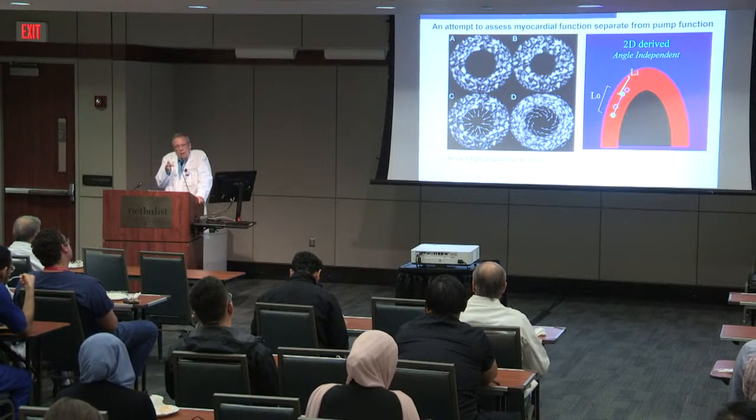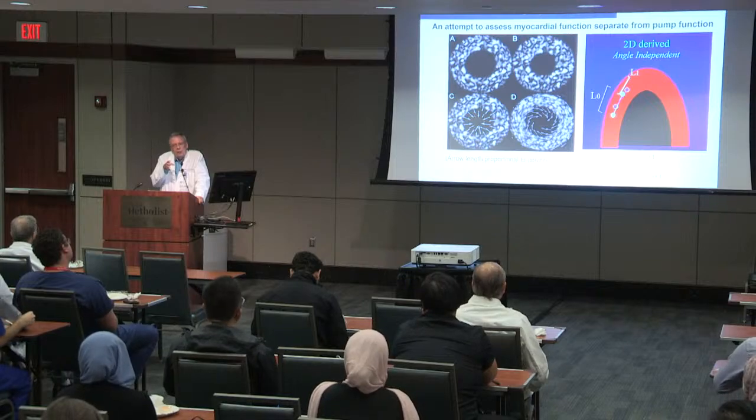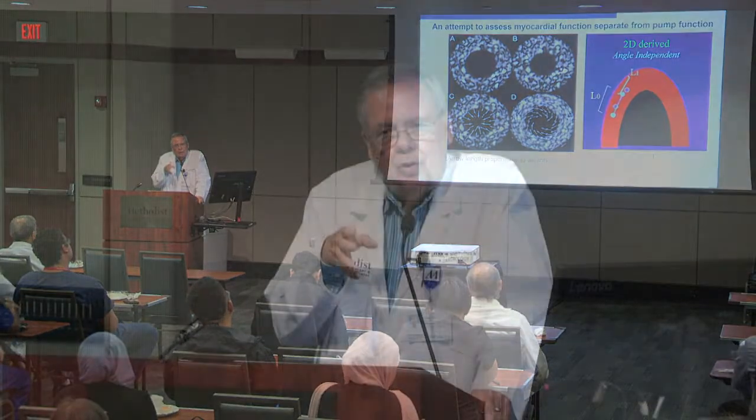Right. So for the sonographers here, if you have trained your eye to do a reasonable estimate of EF, and then you do your 3D with the patient there, and you get a number that doesn't make sense, that's telling you that there's a problem and that maybe you need to go back and readjust those thresholds.